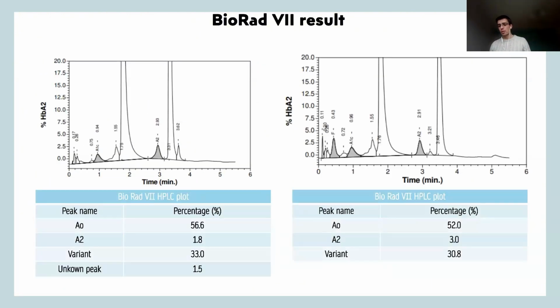As an example, to prove the point that the chromatography needs to be looked at quite carefully, I usually ask the audience, in this case, which are the differences that you can see. So if you feel that you know the answer, do please comment. But for the sake of time and the presentation time that I've been granted, these are two samples, two different ones, and the significance of both are quite different. Both of them are antenatal screening samples, so the patients were pregnant, so they're being screened to assess the risk for the baby developing a serious hemoglobinopathy.